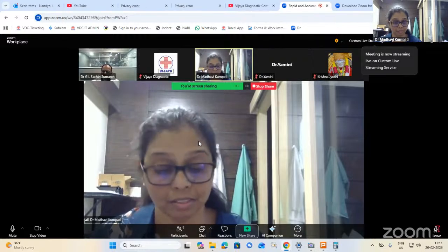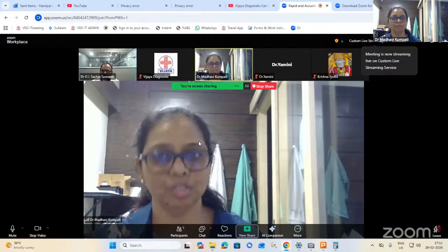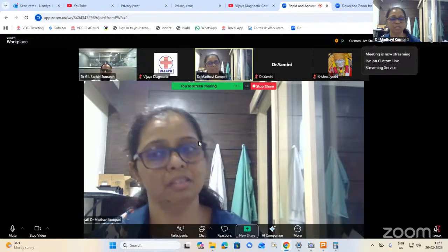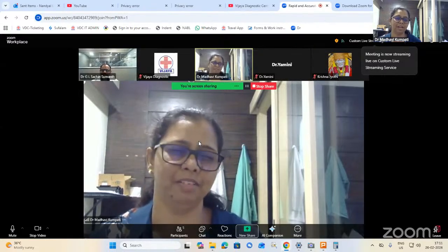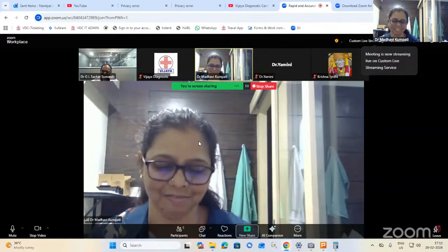And the timing of the blood culture as well, as you rightly said, if the patient has been started on an antibiotic, then it should be before the next dosage of antibiotic. And as a microbiologist, I would be very happy if the sample has been sent before starting an antibiotic.